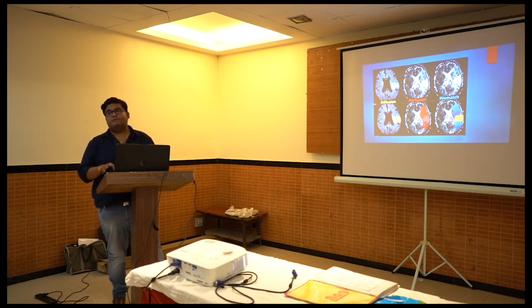If there is no mismatch, it means that the area which is showing the core is already gone, we cannot save it. There is no further need of a thrombolytic.